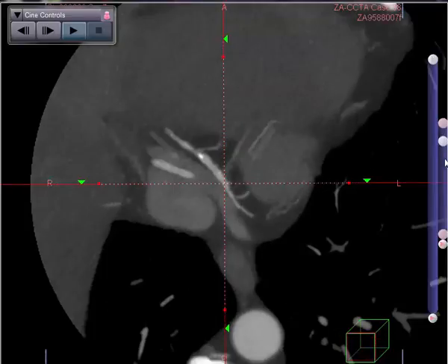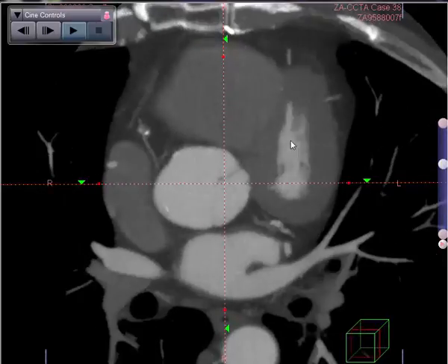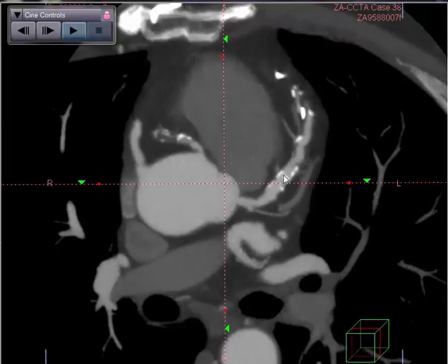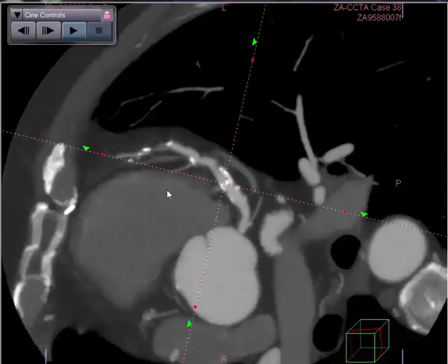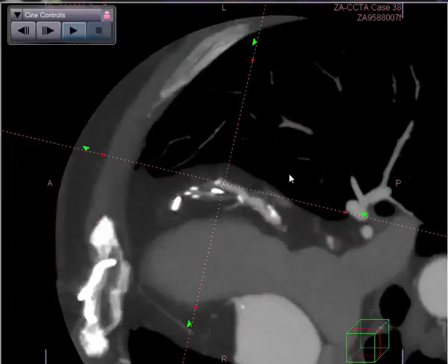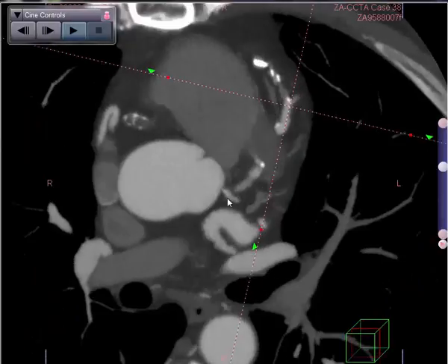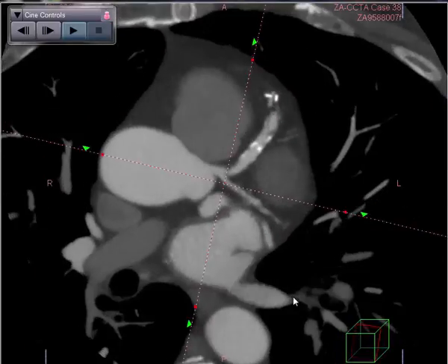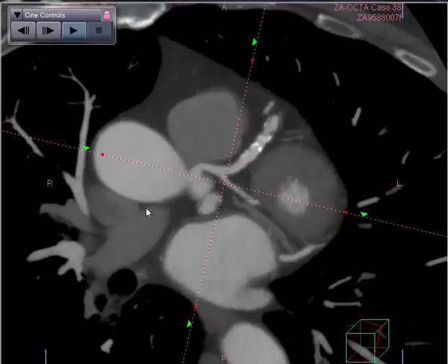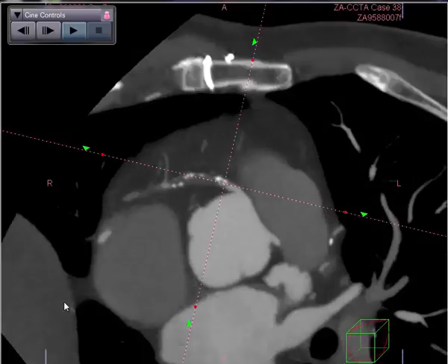If we want to look at the native vessels, let's go back up and take a quick look at them. They are sometimes quite a challenge because they're usually quite severely diseased in these patients. You can see there is some non-calcified plaque in the region of the left main LAD, and some rather complex-looking disease in the left anterior descending. If we look at the region of the left circumflex and obtuse marginal, we can see that there is some disease involving the OM. Finally, the right coronary artery in this patient is occluded proximally, so we only have flow through the bypass graft.